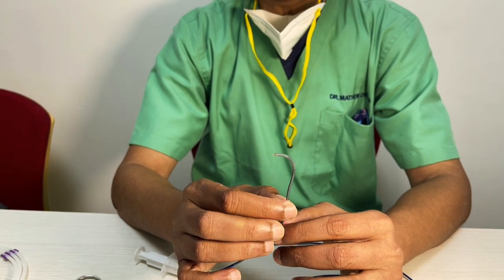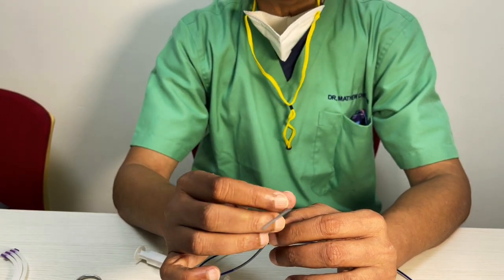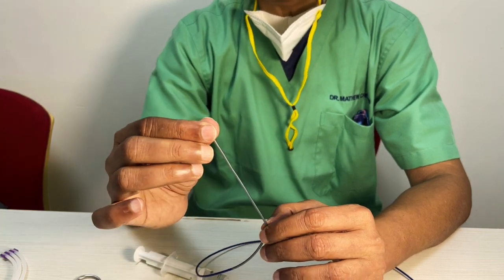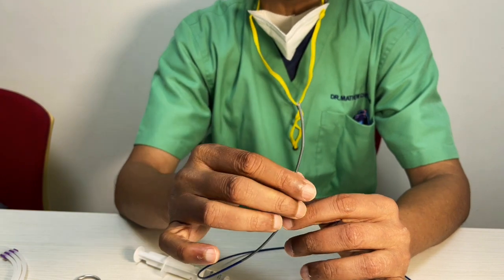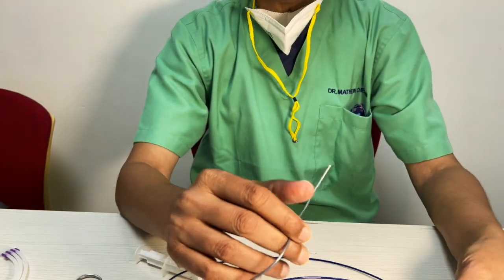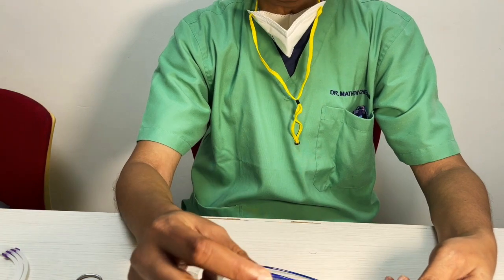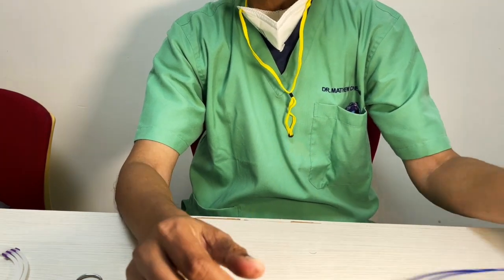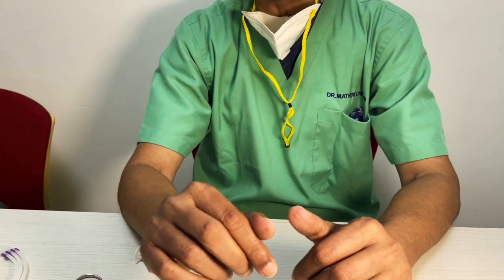Now the Ansel sheath, first of all, was not created for the brain. Because it was not created for the brain, the distal ends of those sheaths were really not soft. And I'm going to show it to you right now. If you're going to use an Ansel-like sheath, it's pretty okay, provided you limit it to the distal common carotid and you don't go into the internal carotid artery.